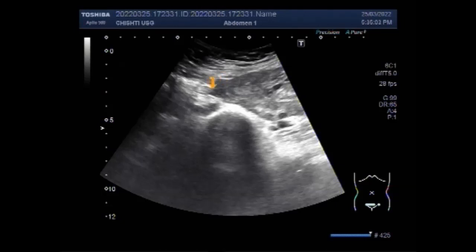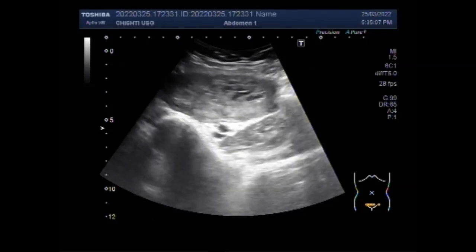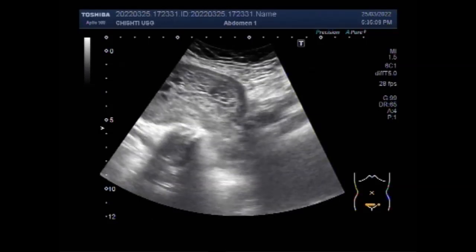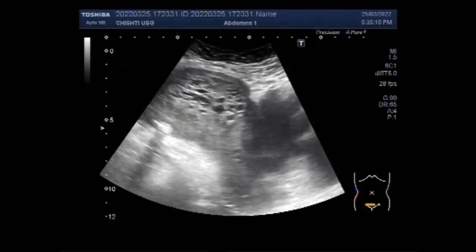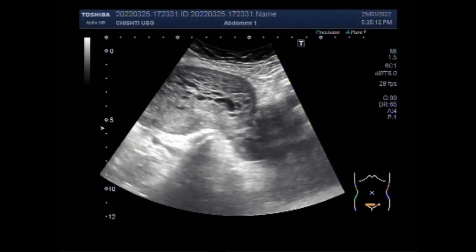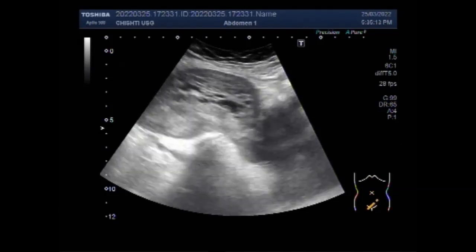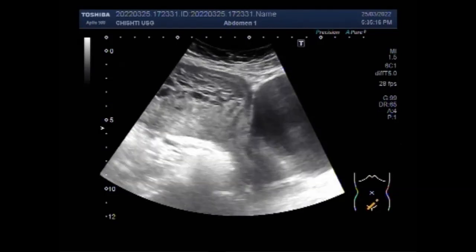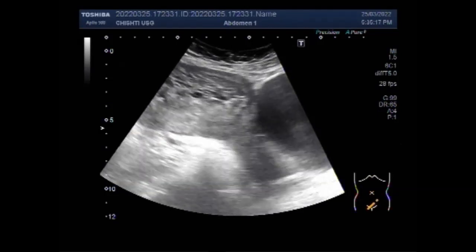Ultrasound scan shows a honeycomb pattern produced by the numerous vesicles. As they enlarge, the image is described to look like a snowstorm, which is due to swollen cysts with bleeding into the uterus.